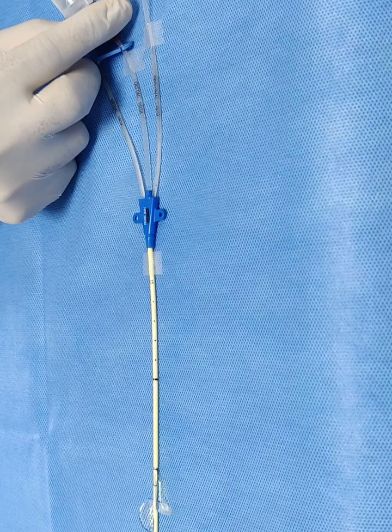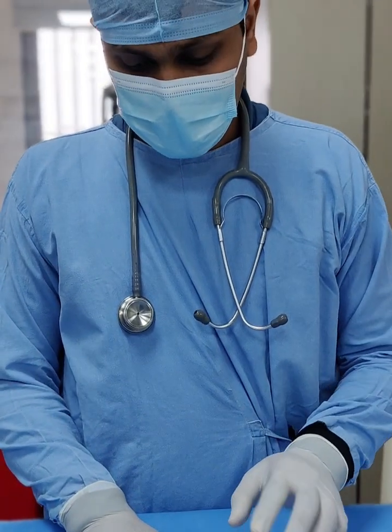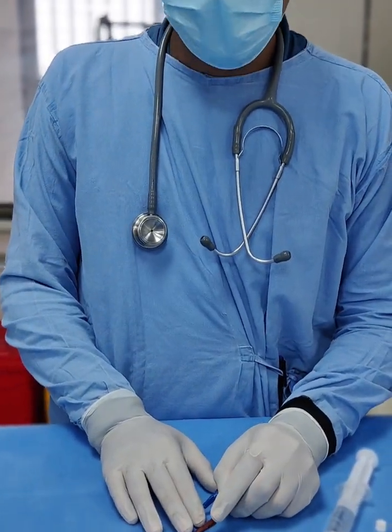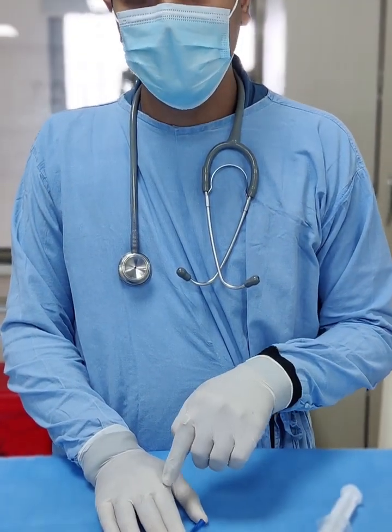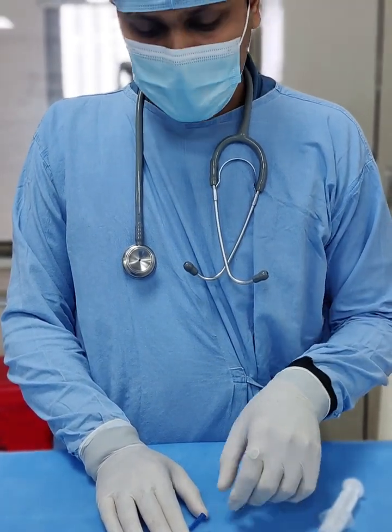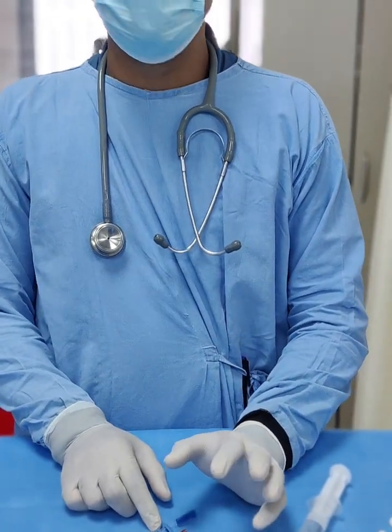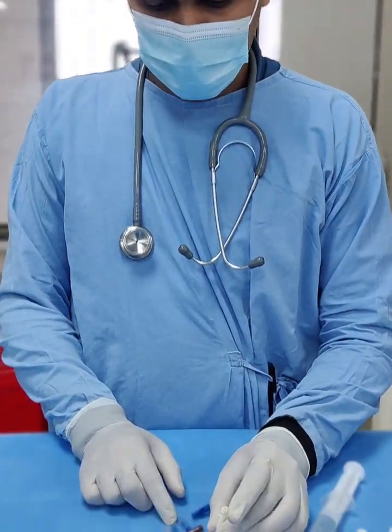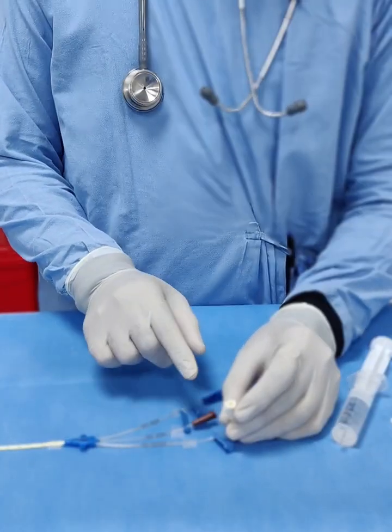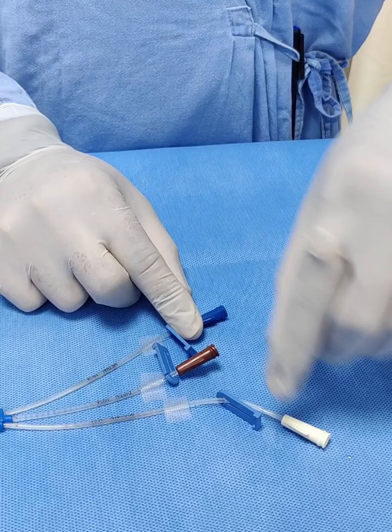The purpose of this video is to learn about the different ports. The distal port, which opens at the tip, should always be used to give IV fluids, crystalloids, colloids, blood products, or whenever you are taking a sample from the central line. All inotropic support or vasopressors like noradrenaline, vasopressin, or dopamine should be connected through the proximal port. Do not mistakenly connect vasopressors to the distal port or give IV fluid from the medial or proximal port.